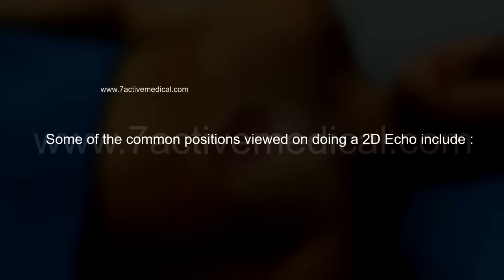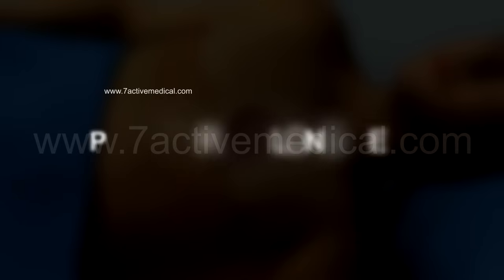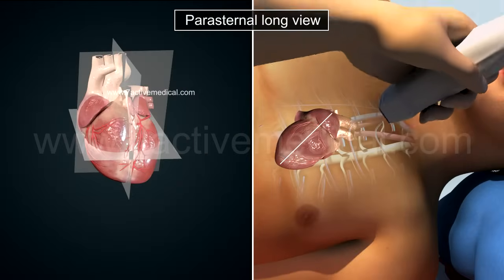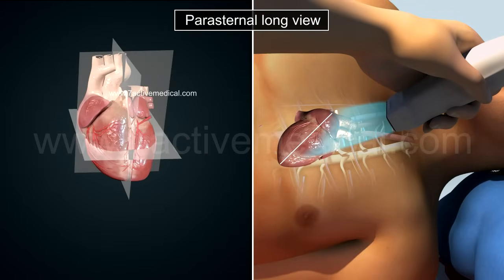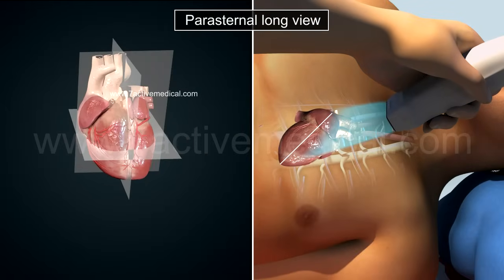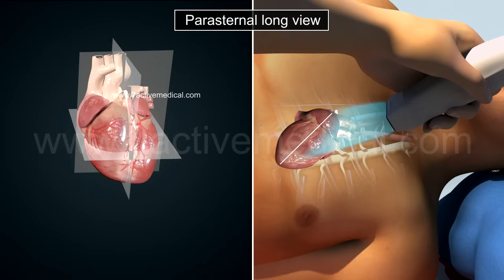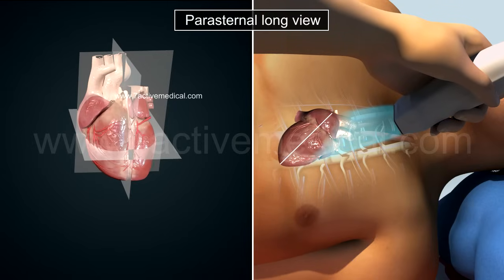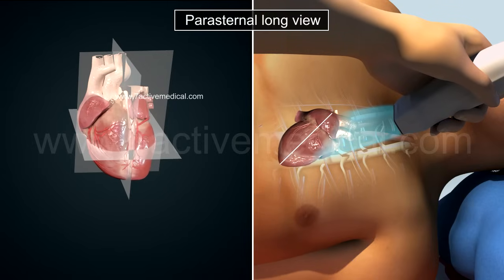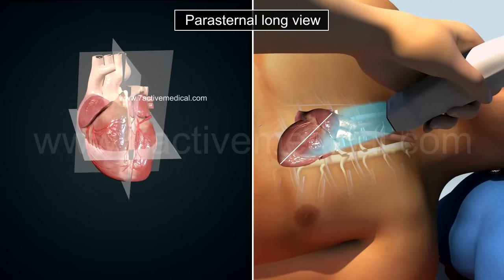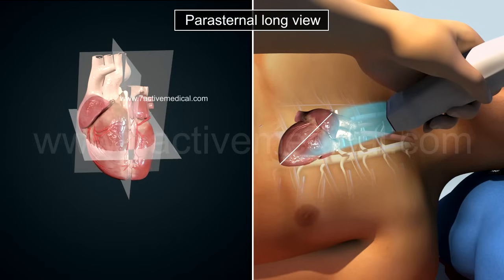Some of the common positions viewed on doing a 2D echo include: 1. Parasternal long view, used to estimate systolic function and to identify a pleural or pericardial effusion. The probe is placed on the third or the fourth intercostal space with the pointer directed towards the left elbow.